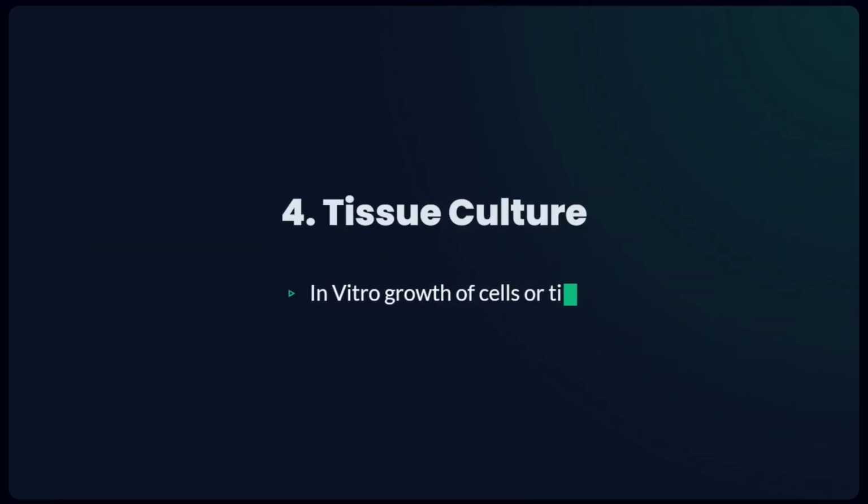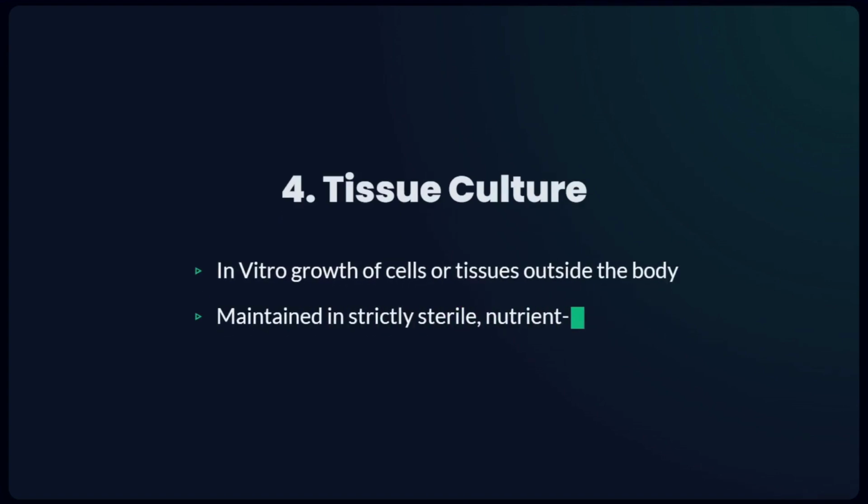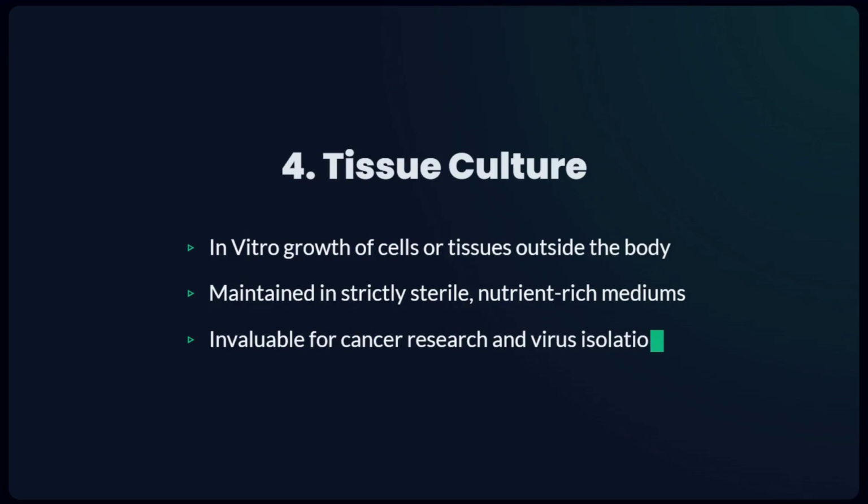Tissue culture involves keeping cells alive and multiplying them inside a lab, completely separate from the original organism. This sterile environment is incredibly important for investigating cancer therapies, genetic engineering, and producing vaccines.